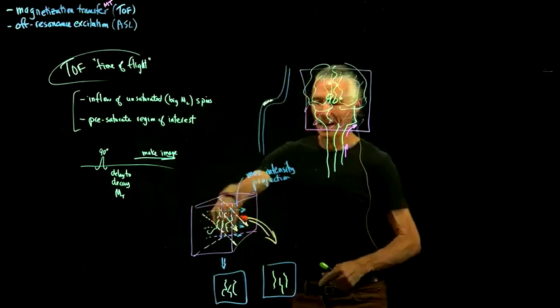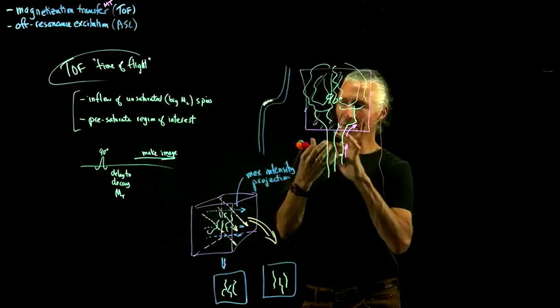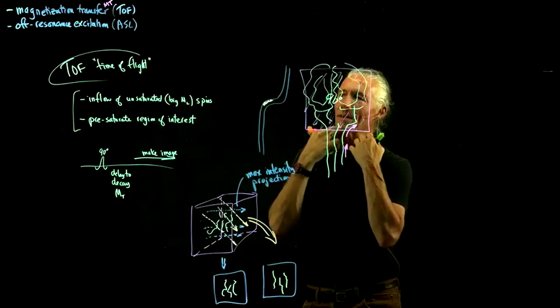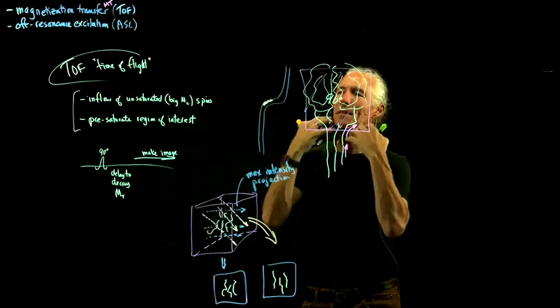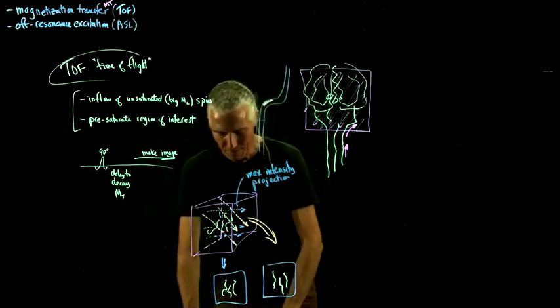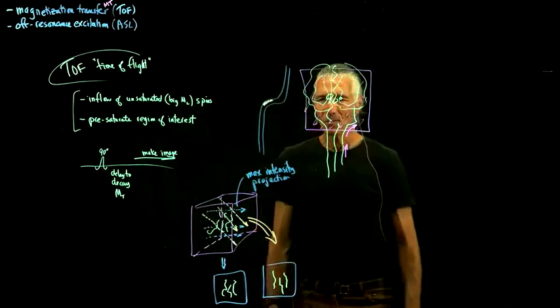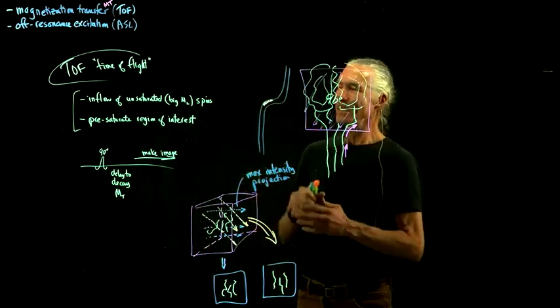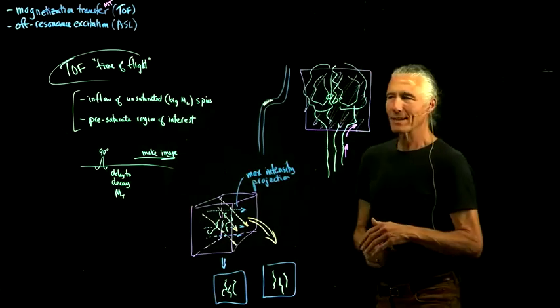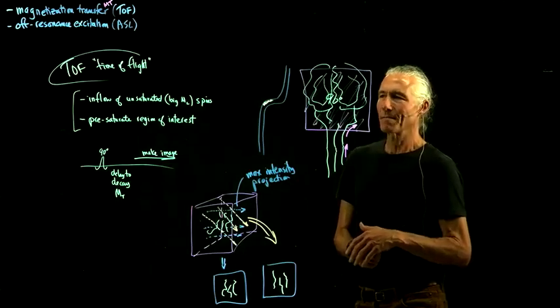So if you just do that all the way 360, you can very quickly get a little rotating, ghostly picture of just their blood vessels, of all their blood vessels coming up into the brain. So it's a very convincing thing to look at. So that's time of flight. And so why did I mention this in the context of magnetization transfer? Because you can use magnetization transfer to improve the contrast.